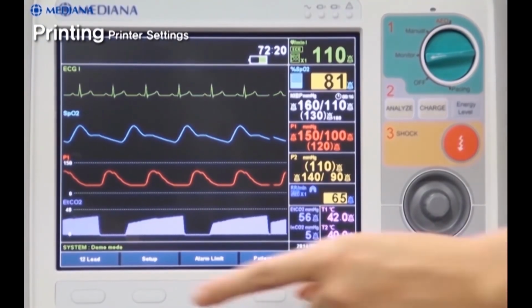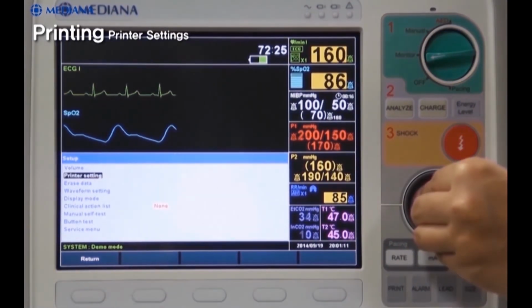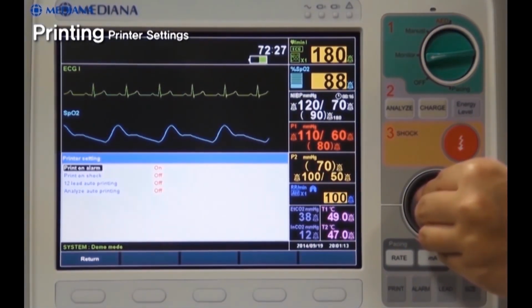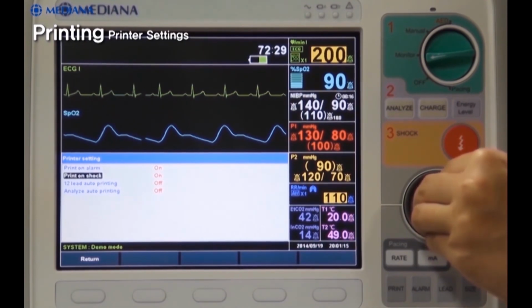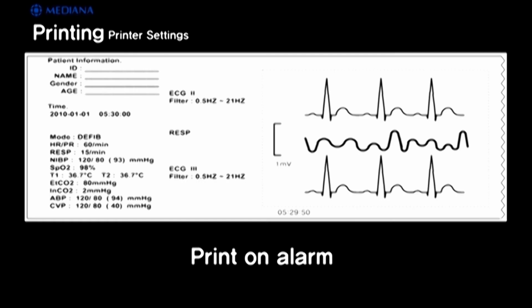Now to the printer settings. To change the printer settings, press the Setup soft key and rotate the multifunction knob to highlight printer setting. By pressing the multifunction knob, you can select the printer settings. If print on alarm is set to on, the D500 will automatically print out the information 10 seconds before and after a physiological alarm condition is activated.